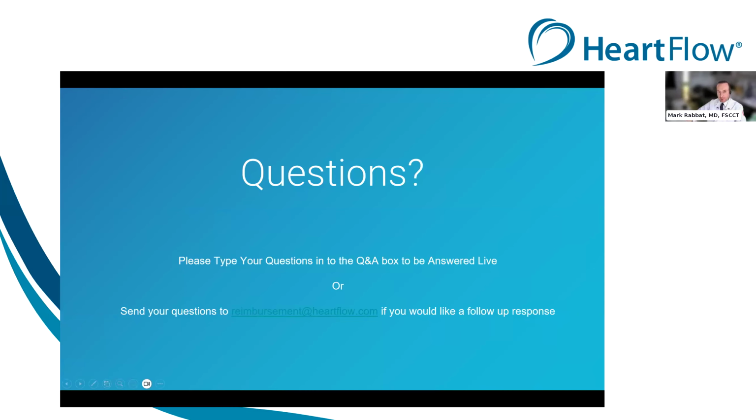Yeah, Cara, that's a great question. In regards to its augmentation for physician decision making, we've seen that FFRCT can safely defer unnecessary invasive angiography, for example. Now, oftentimes there's discordance between what we see anatomically and what's going on at the physiology level. And in fact, Cara, if you look at patients who have lesions that are 50 to 70% diameter stenosis, the majority of them would actually be incorrectly identified for stent placement based off of the anatomy alone. So having that information from the FFRCT and the physiology really adds value.